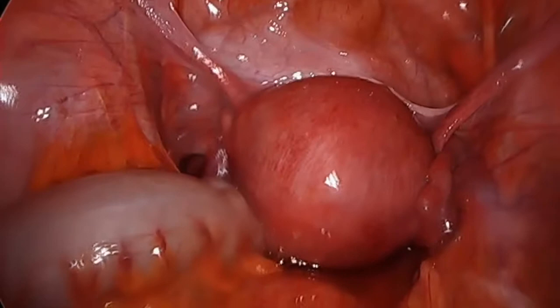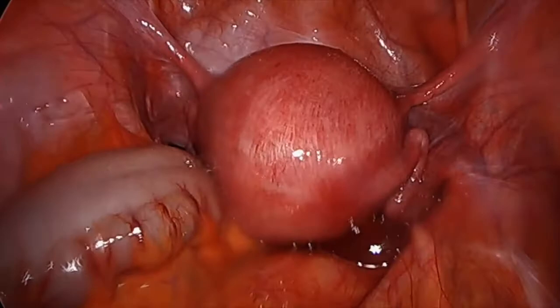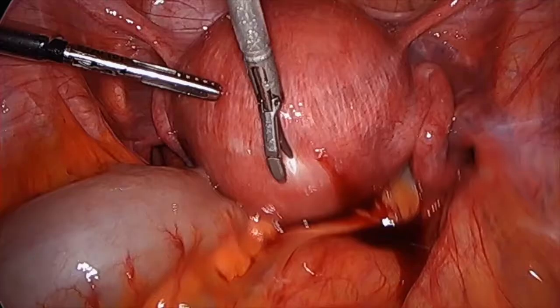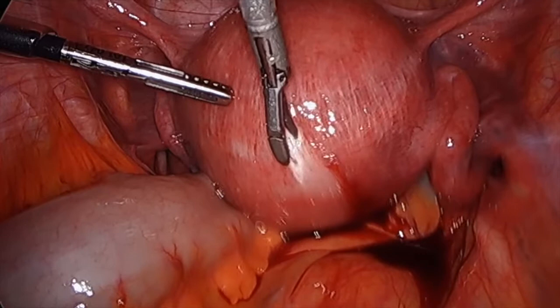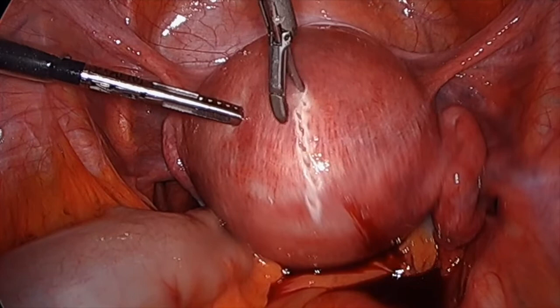We performed the OSADA technique on a 38-year-old woman who did not accept undergoing hysterectomy. As you see, the uterus is adenomyotic.